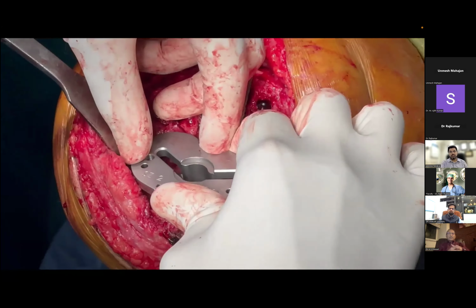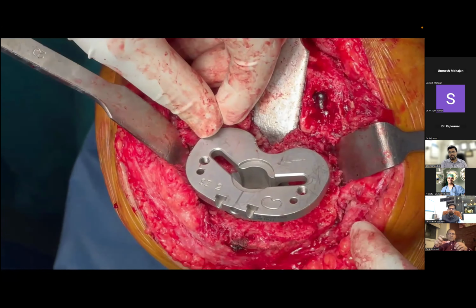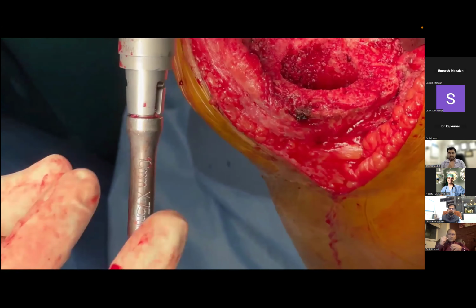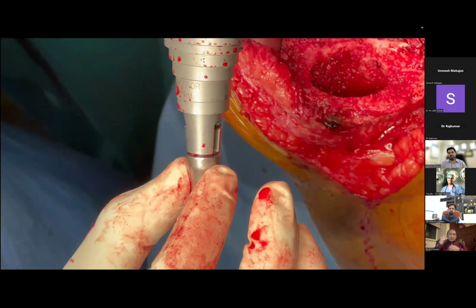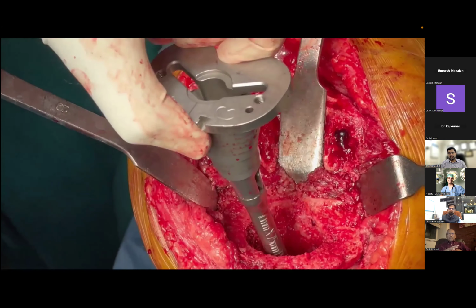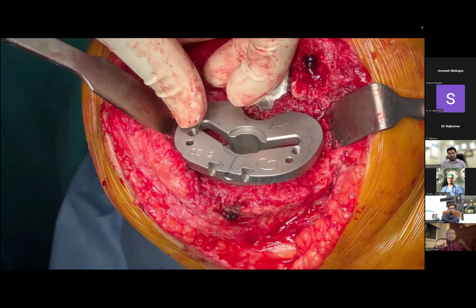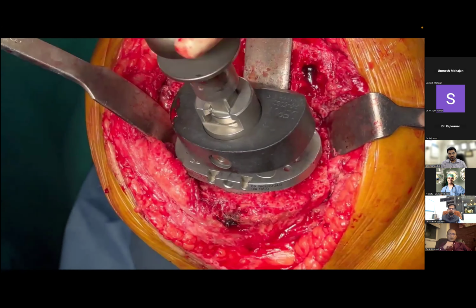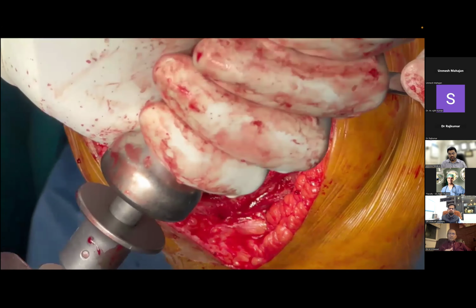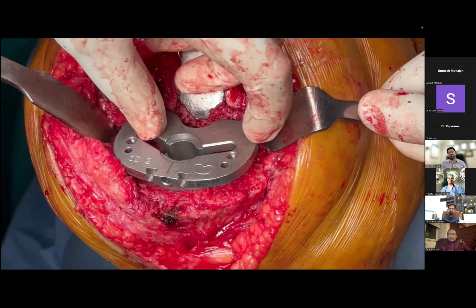If we look at the sleeve, the advantage is while doing trial, the anterior part of the sleeve is fitted in the bone, this size 2. Once we have compacted the bone and fitted the trial, the rotation of the tibial tray can be adjusted as we want. The 20 degrees here or there, it can be easily rotated. So the rotation doesn't have to be rigidly on the anterior side of the sleeve. That's the leeway we have, and we can utilize it very well to get a good functional rotational position of the tray, irrespective of in which position the sleeve has been fixed.